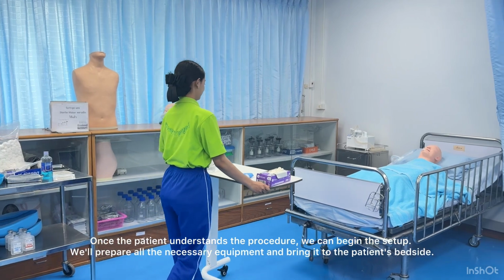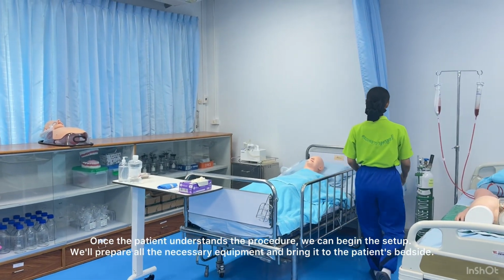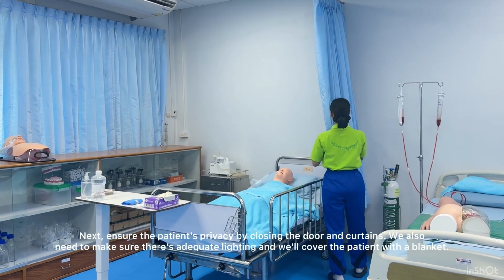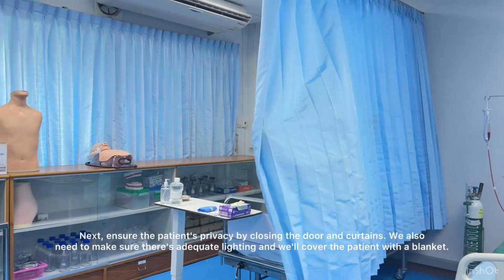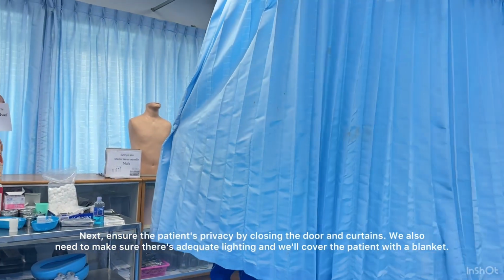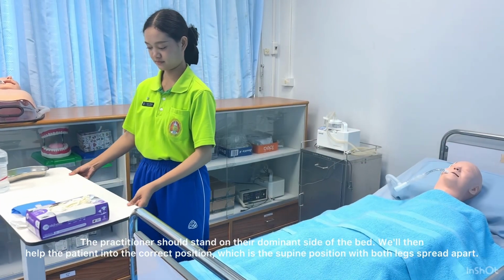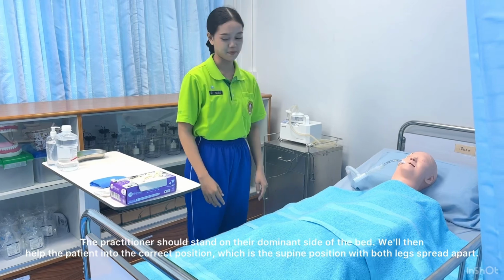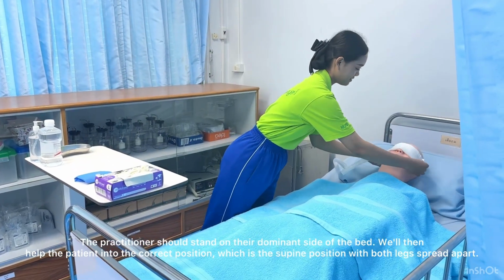Once the patient understands the procedure, we can begin the setup. We'll prepare all the necessary equipment and bring it to the patient's bedside. Next, ensure the patient's privacy by closing the door and curtains. We also need to make sure there's adequate lighting, and we'll cover the patient with a blanket. The practitioner should stand on their dominant side of the bed. We'll then help the patient into the correct position, which is the supine position with both legs spread apart.